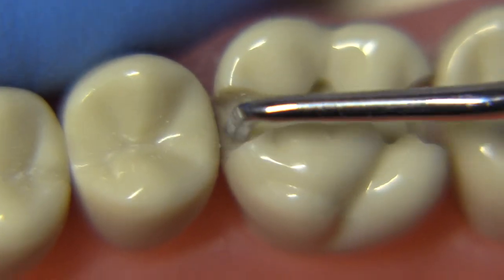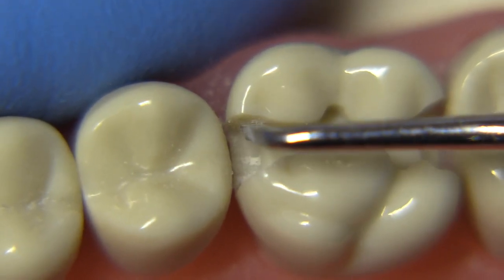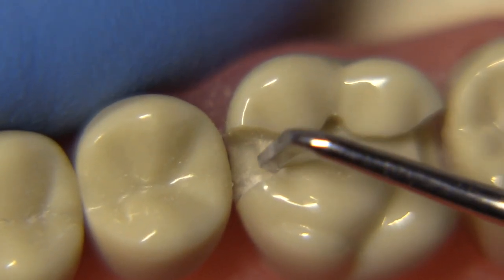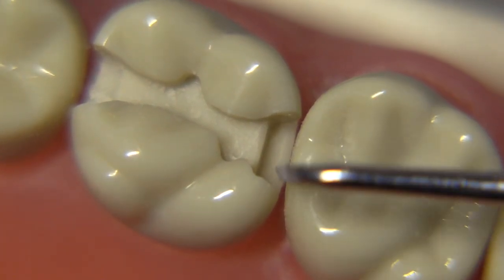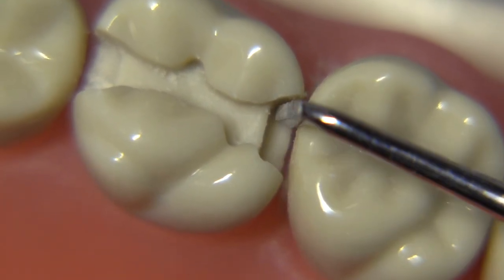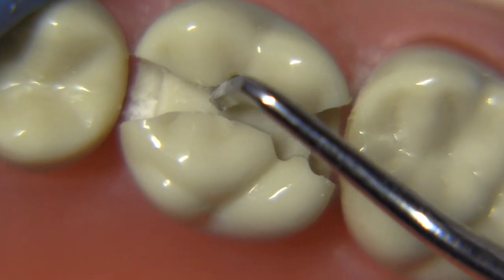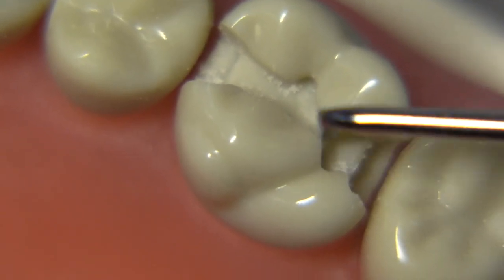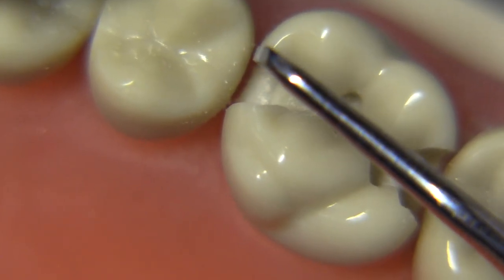We don't want razor-sharp line angles on an amalgam — and definitely not on a composite — but making them a little cleaner is highly recommended. I think dental schools are going to start to pick up on the importance of this bur and will be recommending it in their bur blocks in the future — it'll just take a few years for the word to get out. We're doing a little cleanup work here with the 10-714 enamel hatchet. You can see there's a bevel at the gingival that I placed with a GMT — the outline is looking pretty smooth, with no sharp or irregular areas.